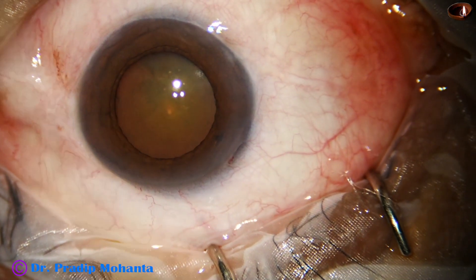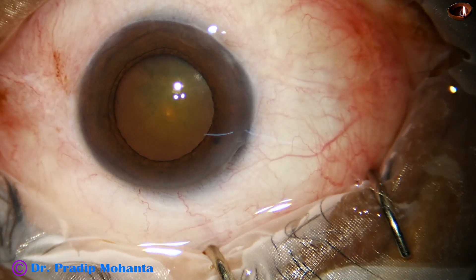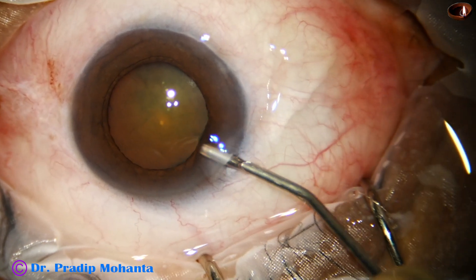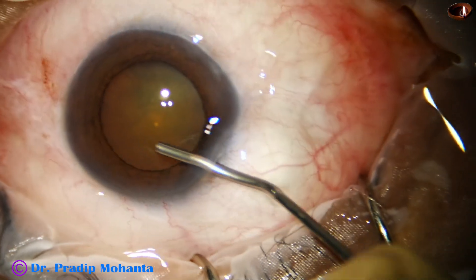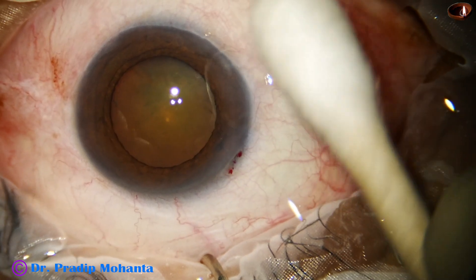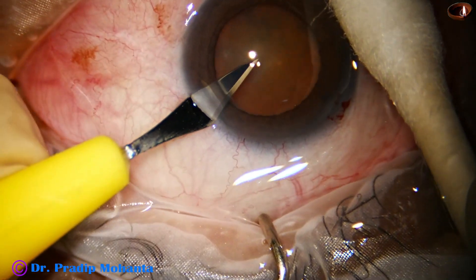We can see that the pupil has dilated to about 4.5 to 5 millimetres. A bit of adrenalin is added and then the anterior chamber is filled up with visco. With adrenalin and visco, the pupil has dilated to about 5.5 millimetres.